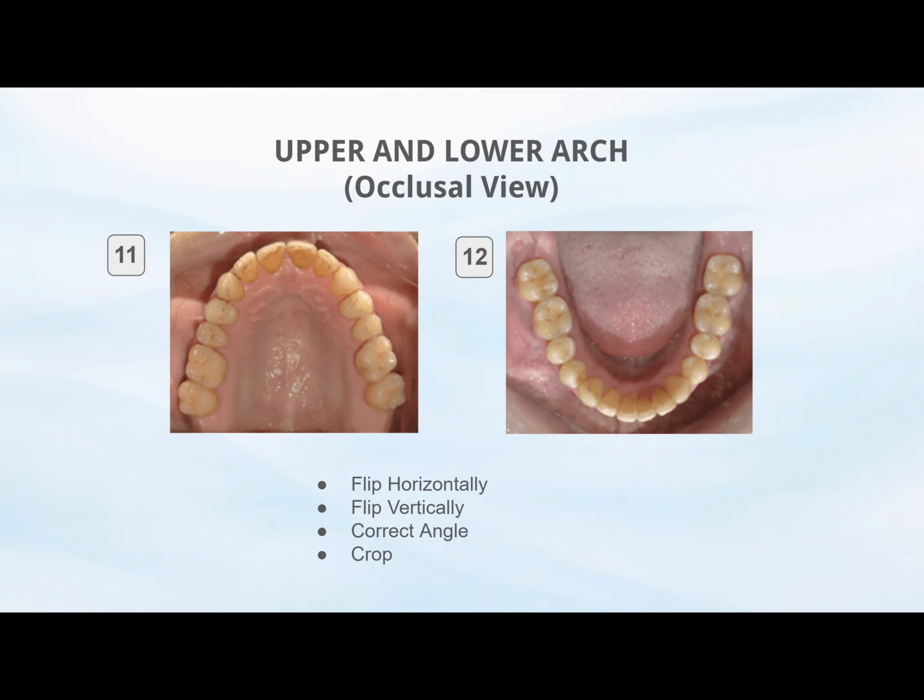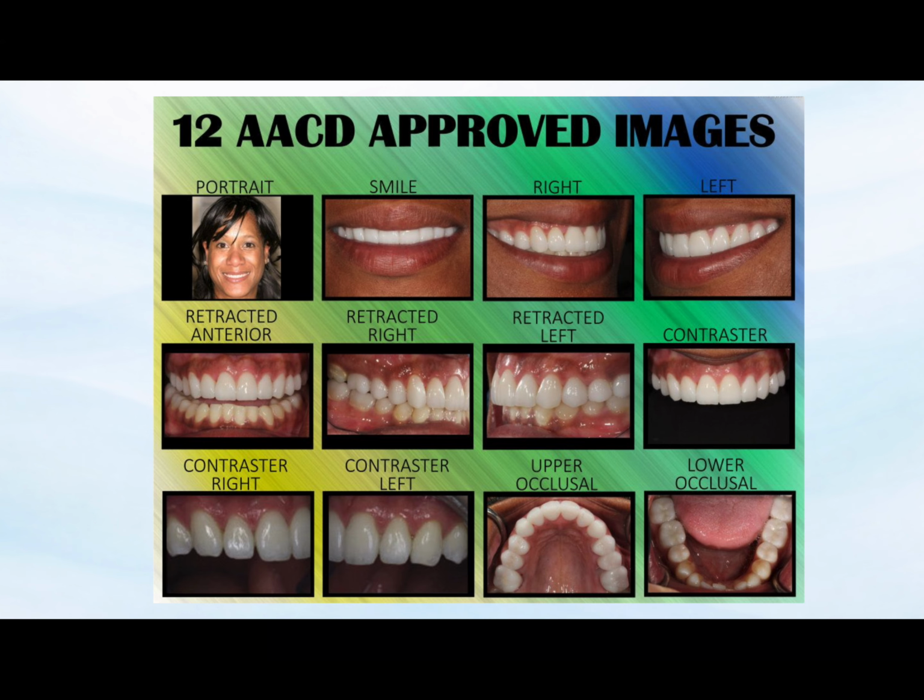There's going to be a different presentation on the photographs for orthodontic purposes, but these are the pictures that you have to take and get really familiar with that series, the 12 pictures, so that whenever we have cases that require cosmetics or restorative cases, make sure that you get all of your supplies ready and take all the pictures and learn how to put them together in a file or in a format where you can see them all in a single view.